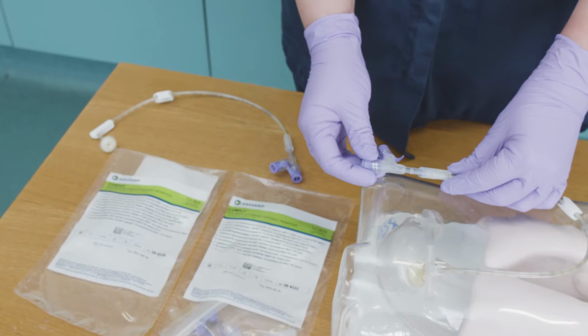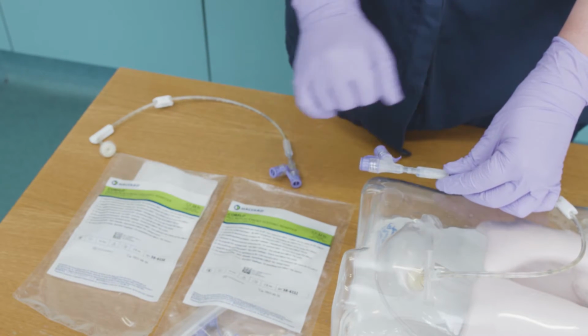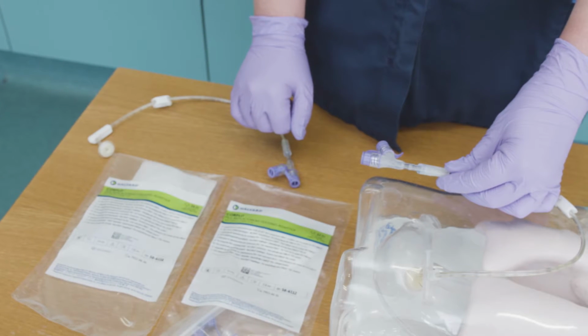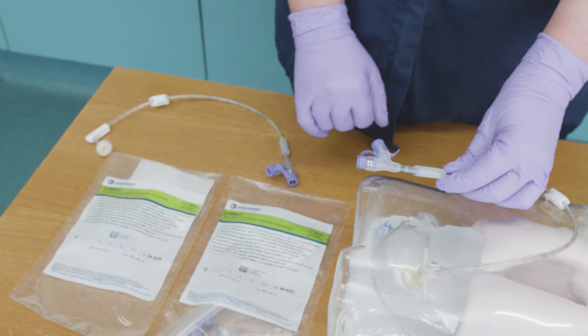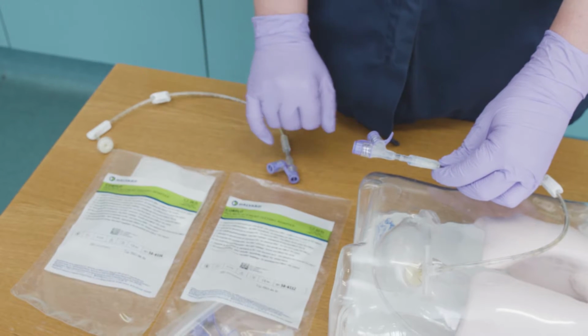This video will explain how to replace the feeding connector or Y adapter on a Corflo PEG tube and explain how to advance and rotate this type of PEG tube. You will need to replace the feeding connector on a PEG tube if it has broken off, has split or is leaking. You will need a replacement Corflo Y adapter of the appropriate size.